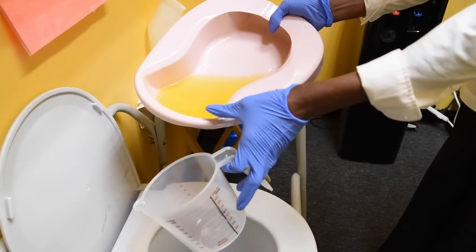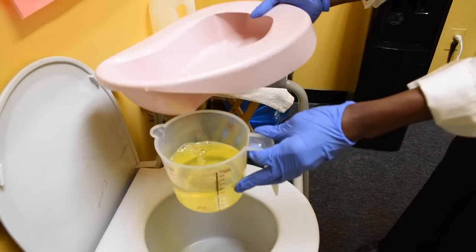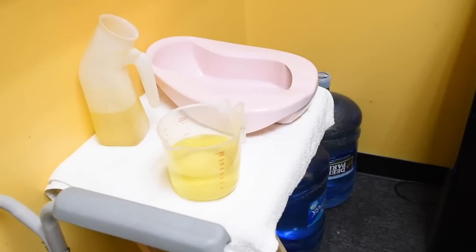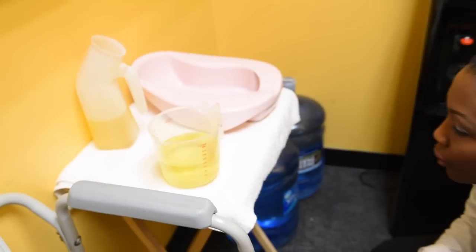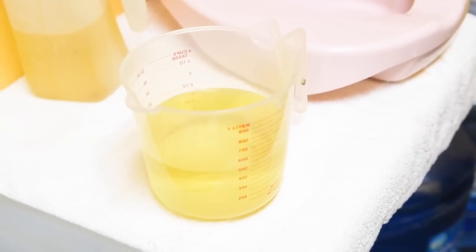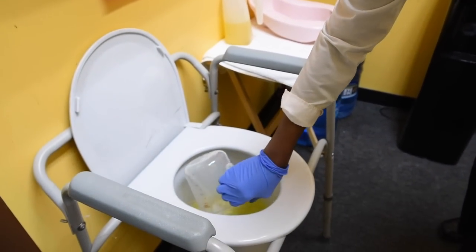When we are emptying urine out of a bedpan, we empty it from the side. So this is what you would do. Okay. Completely pour the urine into the measuring cup, then sit the measuring cup at eye level, squat to take the measurement of the urine. You do not tell the examiner what you are reading. You will simply keep it in your head till you finish and record, all right? This is your next step.